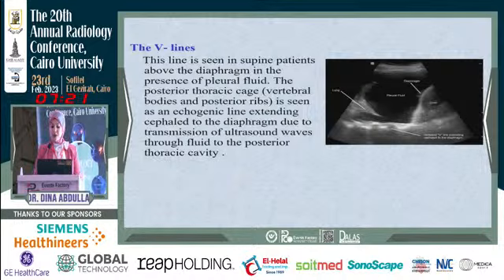The lung curtain. This term refers to the edge of the normal lung artifact visible at the costophrenic angles. On inspiration, the descent of the lung artifact transiently obscures deeper structures such as liver, spleen, and kidneys, like a theater curtain drawn shut to hide the stage behind it.